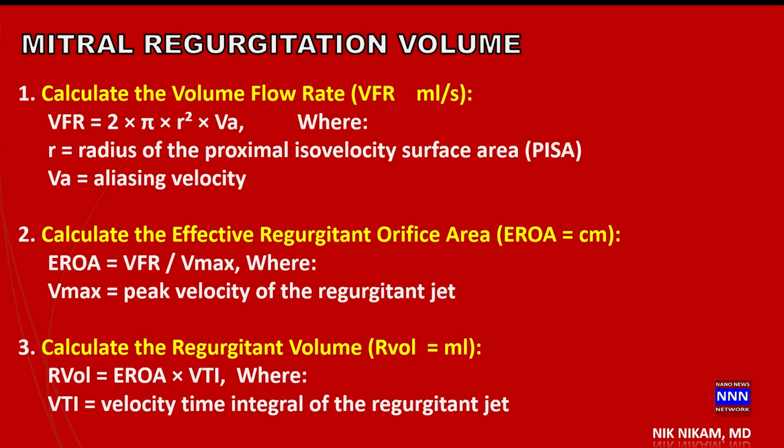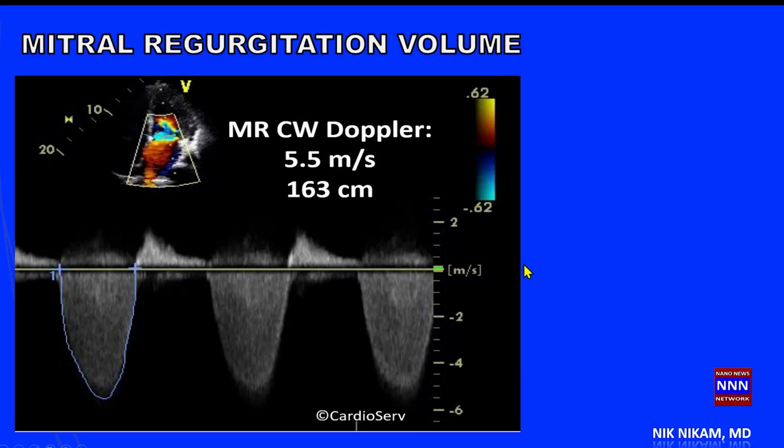So you have to, as I said, there are three different terminologies used here, each depicting a different aspect of the mitral regurgitation. It still doesn't tell you how severe the mitral regurgitation is. It is just telling you there is mitral regurgitation, the volume of mitral regurgitation per second, and the mitral regurgitant flow per beat. All right, let's move on to some more real examples here.